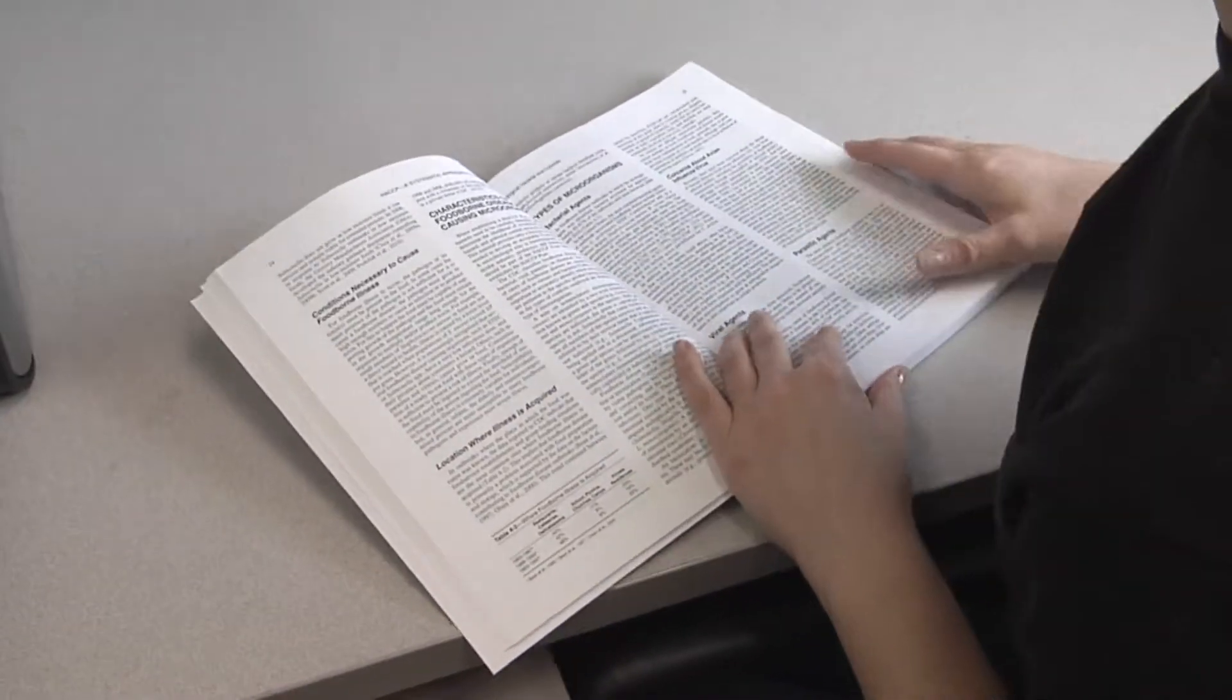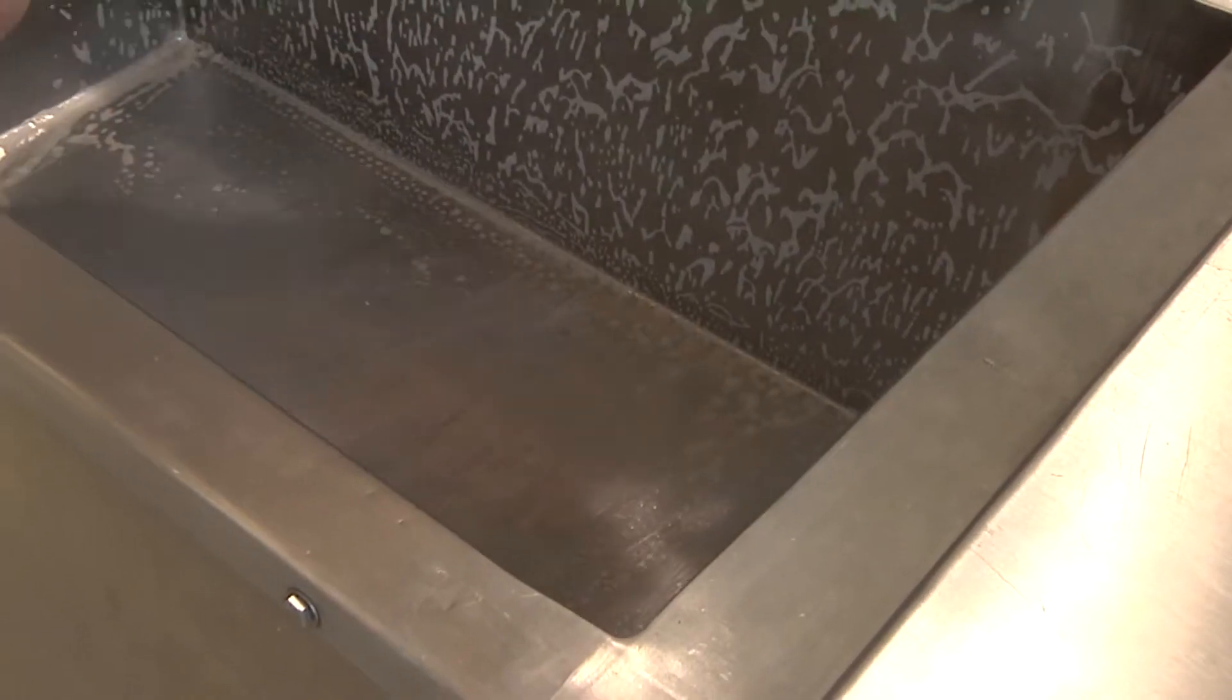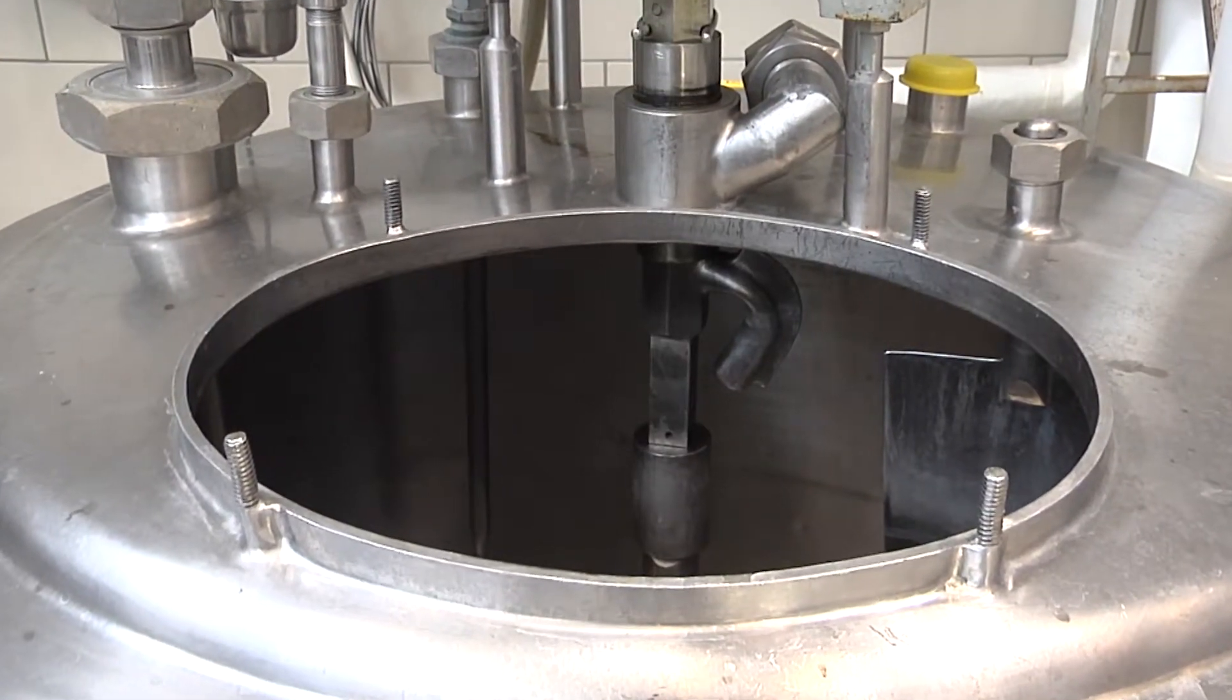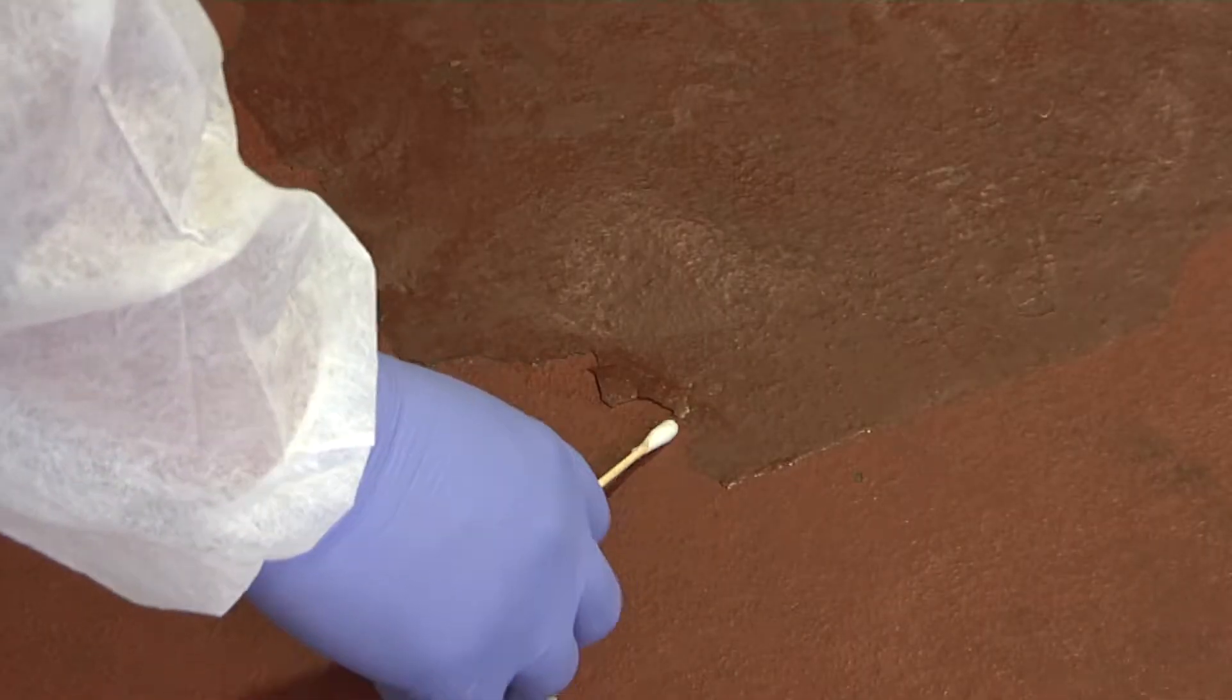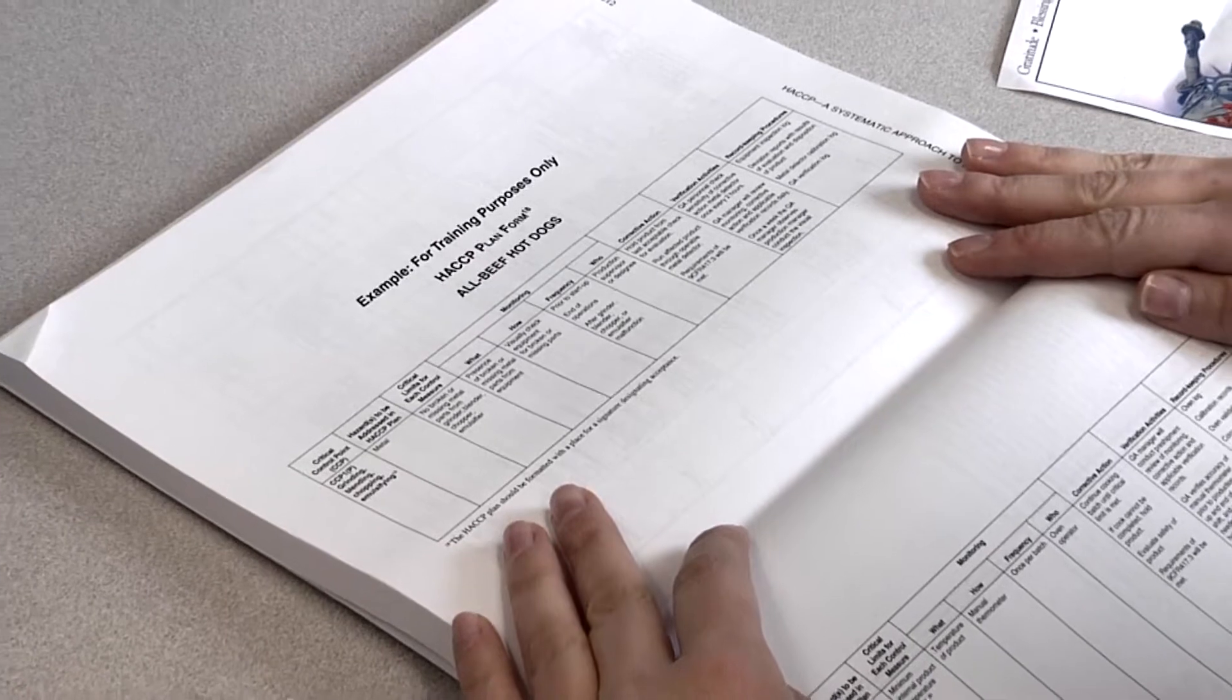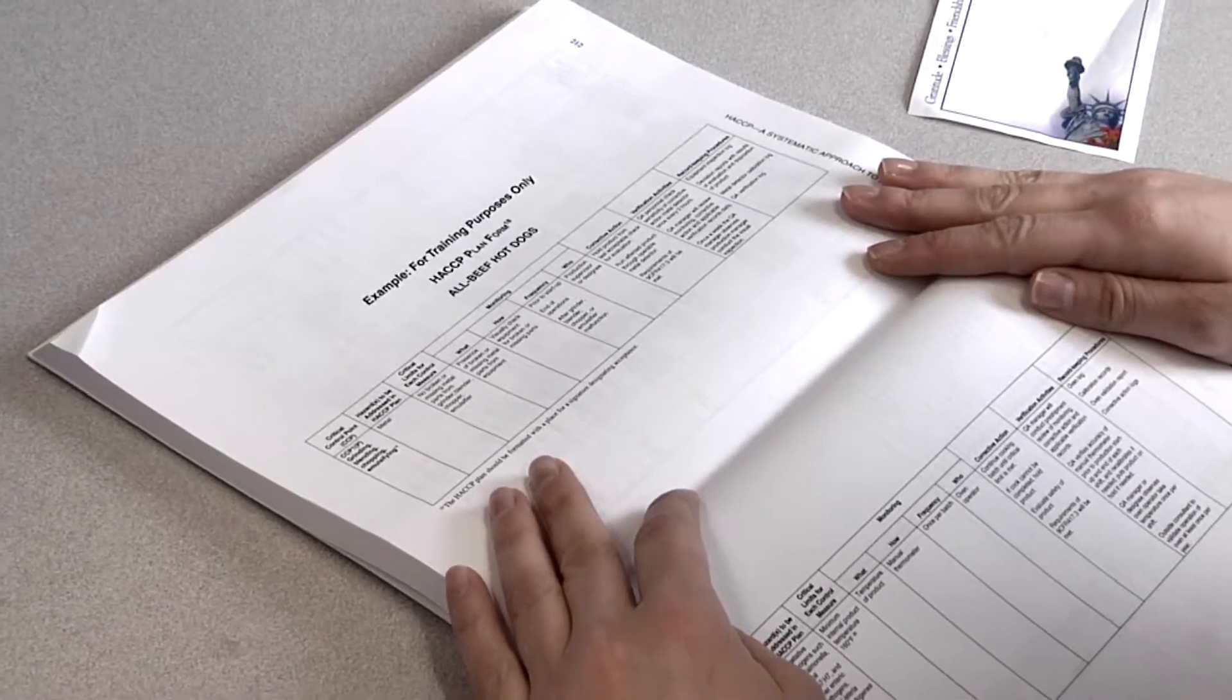To determine whether a processing environment has been properly cleaned, as well as to tell whether pathogens are present, environmental testing is conducted. It is considered a verification procedure as part of a company's HACCP plan for sanitation, as well as Listeria control.